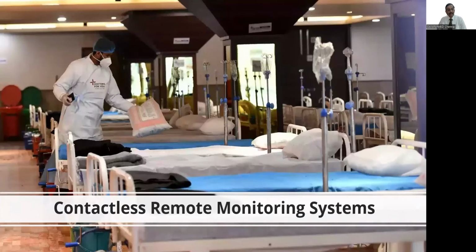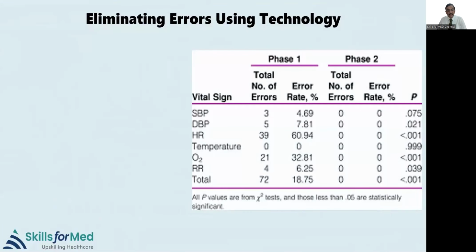So there are again other contactless remote monitoring systems available. Very amazing. Initially, I was very skeptical about it. There is only a sensor underneath the patient's bed, and it grabs all the vital parameters of the patient using a quartz-based technology. And they have done several studies and proved that it is as accurate as an ICU monitor. So then you can see the nursing effort goes down a lot, and two, the error comes down also quite drastically.